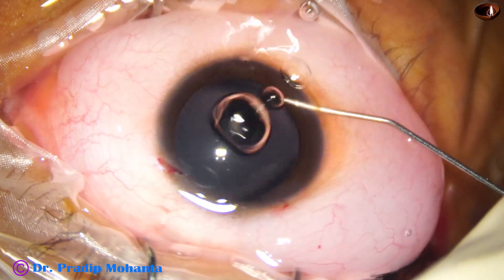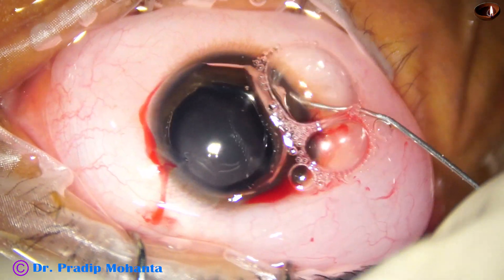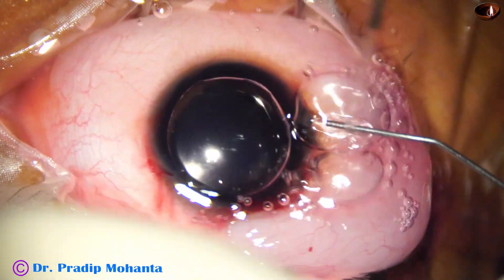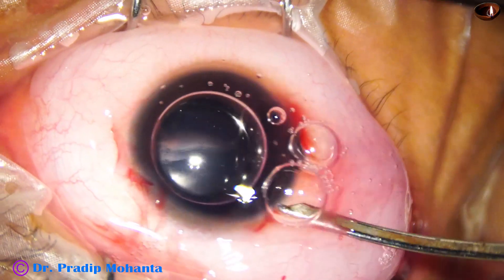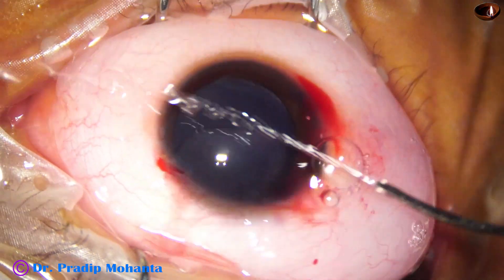An air bubble is injected. Trypan blue dye is applied over the anterior capsule. The dye is washed out. This is adrenaline. With the help of this 23G Simcoe, the dye is washed out.